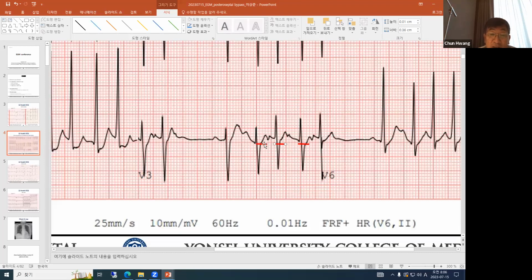그래서 내가 보기에는 second QRS complex의 retrograde P하고 third complex P하고는 똑같은 것 같아. 그런데 이 중간에 낀 애는 RR 인터벌이 짧아지면서 생긴 건지, 아니면 RR 인터벌이 짧으면서 you went through a different pathway. Could be a slow pathway. It's possible. The differentiation은 eyeball 할 적에는 40 millisecond 되는지 난 모르겠어. So it's possible that whether you're tachycardia.